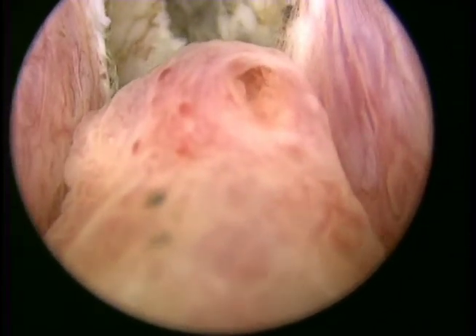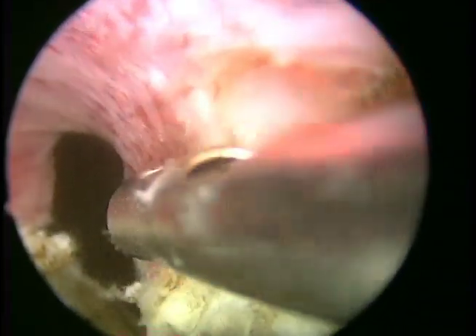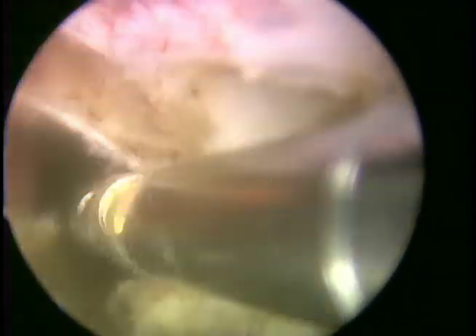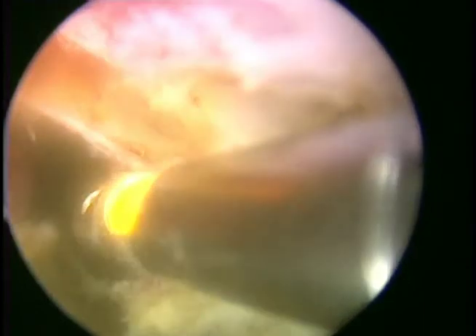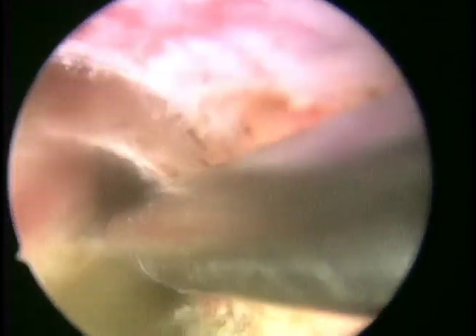The power setting here is at 80 watts, and we will continue to create a sulcus groove through the adenoma down to surgical capsule, best first visualized at the bladder neck at that 5 o'clock position. We tend to develop the left lateral lobe and treat that through a vapor technique by initially finding the capsule and working that tissue down to capsule, then moving to the contralateral lobe. This is all done after the floor has been treated.